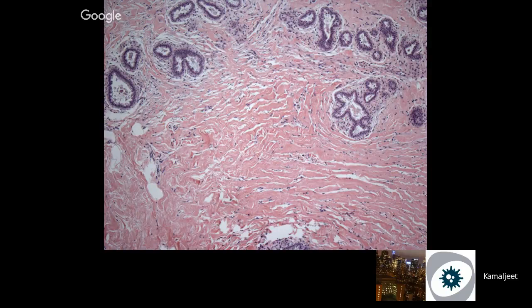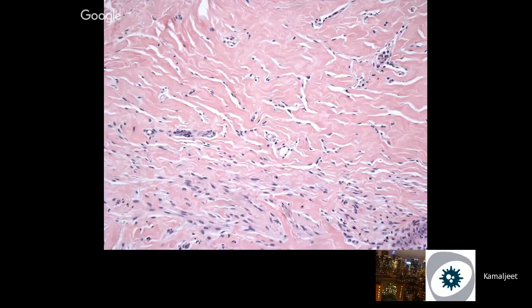It can come in two flavors. One is this, where it doesn't form a mass, and it's just a diffuse, incidental finding. The second is nodular PASH, where actually the patient will get a targeted biopsy of the mass, which is PASH. If you have any ambiguity about the diagnosis, you can stain it. It would be CD34 positive, BCL2 positive. The cells will express the receptors, the ER and desmin.